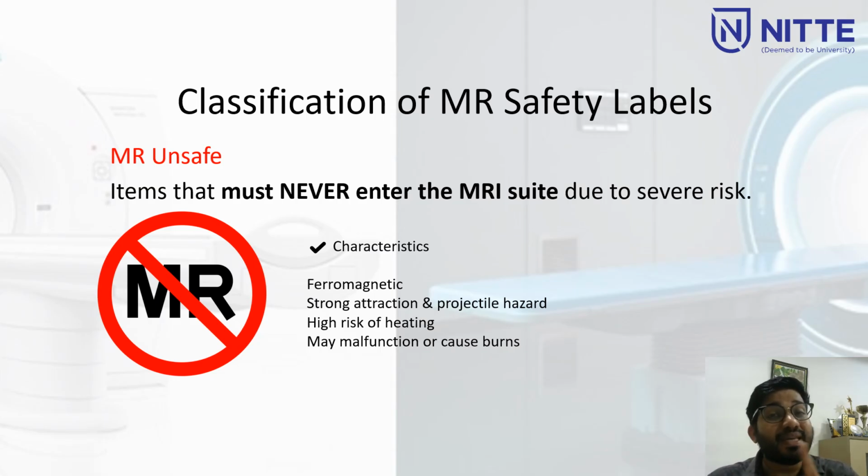Because earlier pacemakers had ferromagnetic components such as a reed switch inside, which were MR unsafe. So we have to particularly ask about the pacemaker and discuss with the heart specialist which particular pacemaker has been implanted, and we have to confirm whether it is modern or conventional before proceeding with the MRI scan.